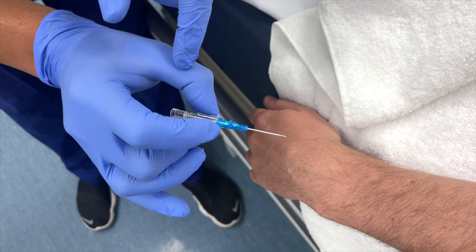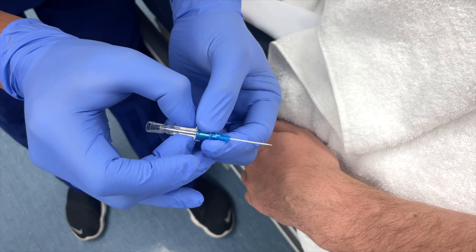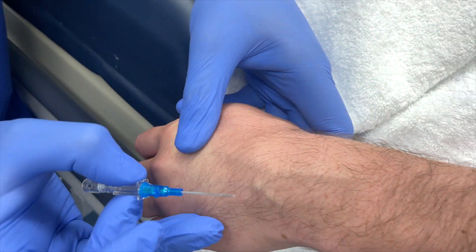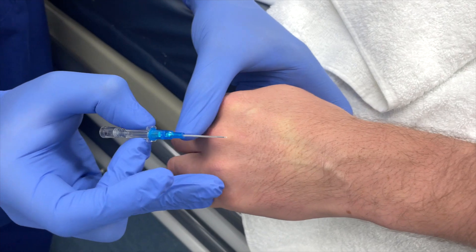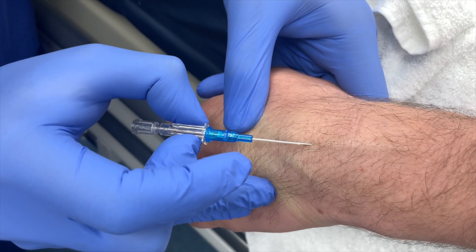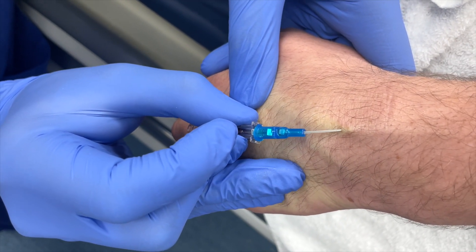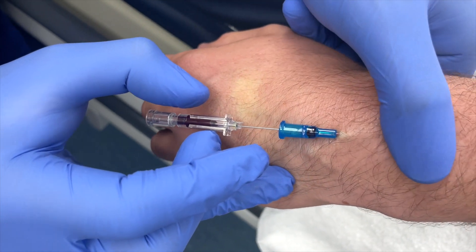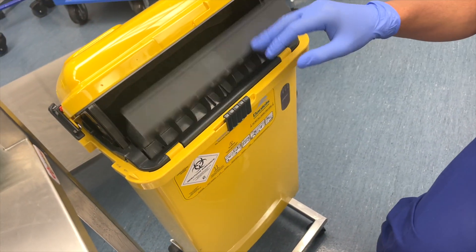I hold the cannula with my thumb and middle finger on either side, pointer finger free to see the chamber and feed off the cannula. I loosen the cannula as shown in my other videos, then click it back into place. I tense the skin with my other hand, making sure my finger isn't in the way of lowering the needle angle — it's always to the side. I go in over the sterilized site, watching the chamber for flashback. Once I see flashback, I level out, advance a few more millimeters, then feed off the cannula without changing my hand position.